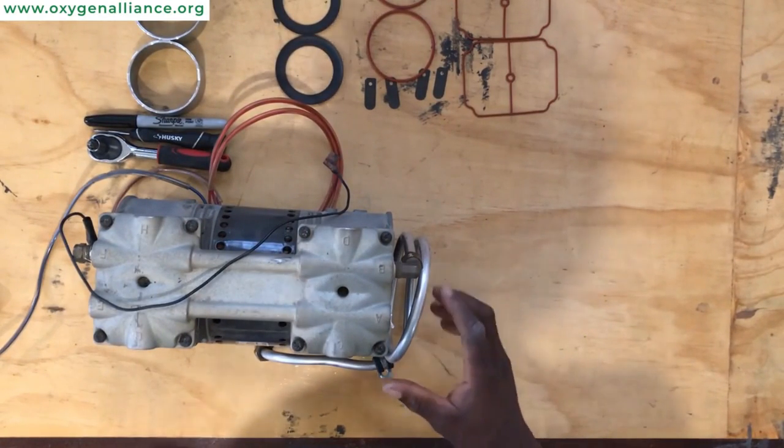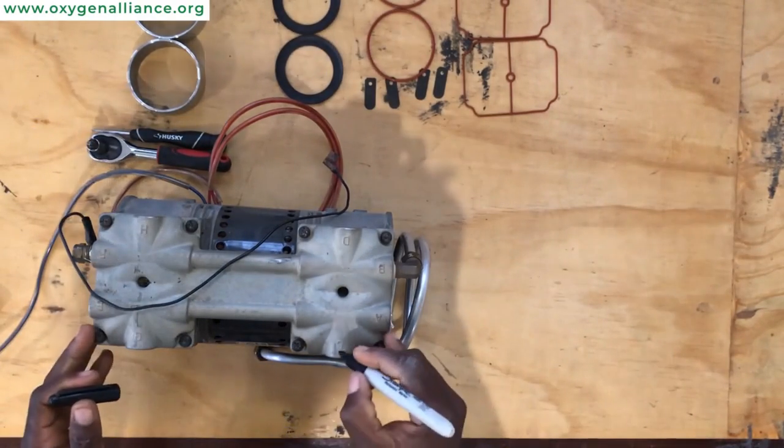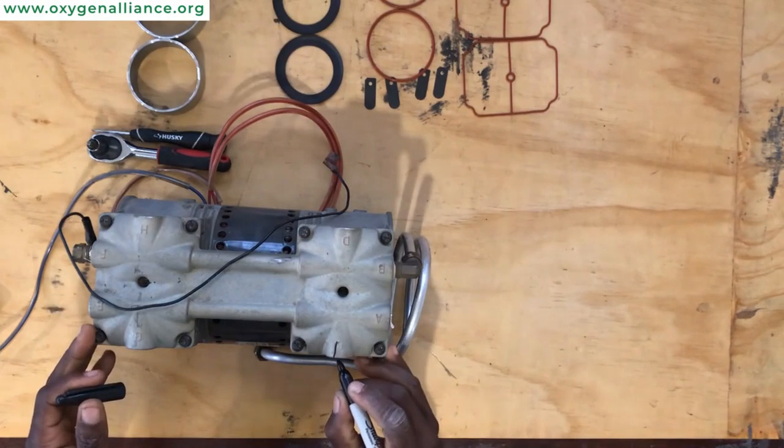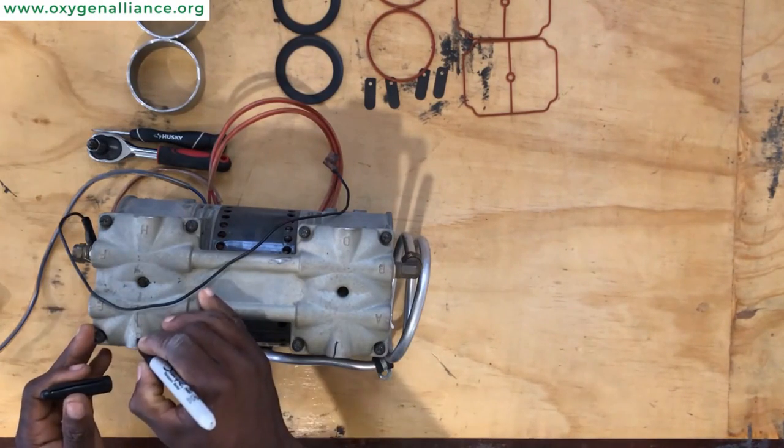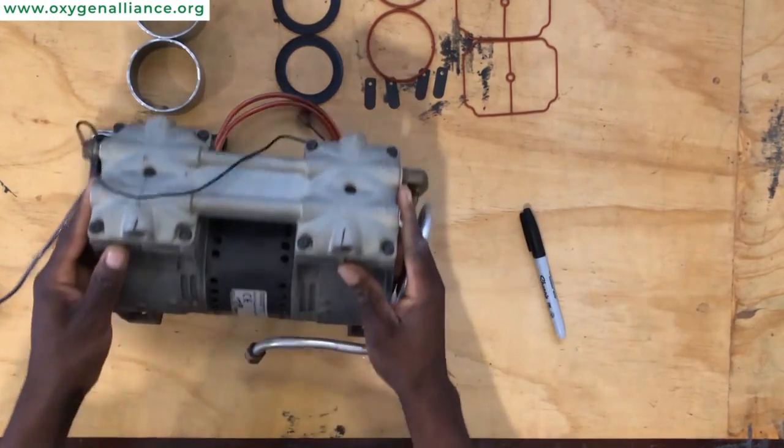To begin with, make sure that you mark the head of the compressor with a sharpie so that you know which side is the front and which one is the back. Make sure you mark the top of the head and the side of the compressor.